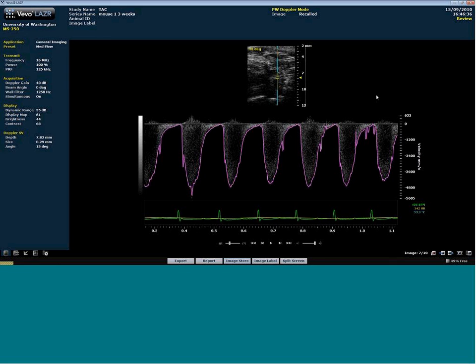So that might help you do some design of experiment to figure out if you've only got, say, a 550D or you've only got a 400, how can you reliably measure, and if you have the flexibility to go to an even lower frequency, a 250 probe, then you can drive those velocities up a lot higher. Big thing is going to be positioning.